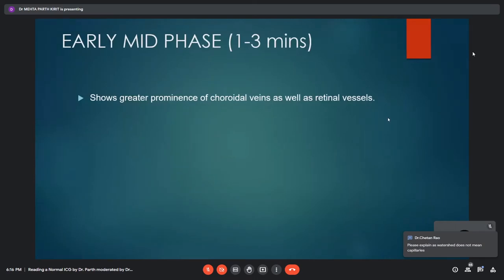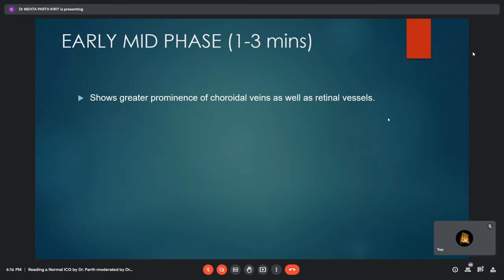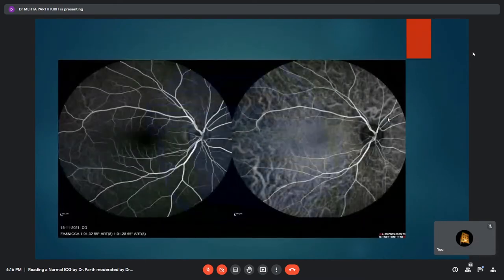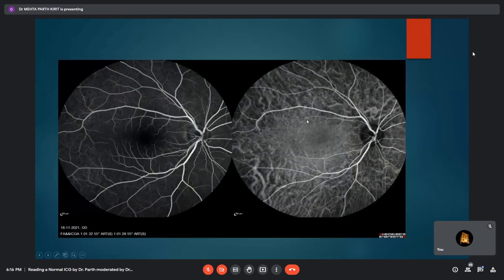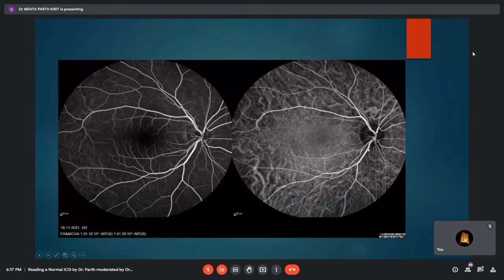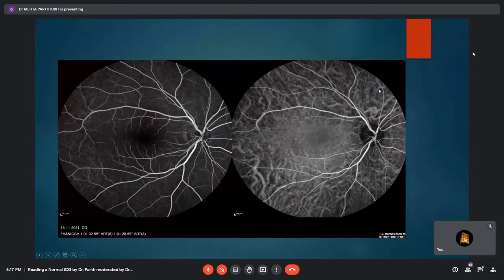Coming to the second phase — the early mid-phase, which lasts about 1 to 3 minutes — there is greater prominence of choroidal veins as well as retinal vessels. The choroidal veins appear as large caliber veins seen against the background of retinal vessels. The retinal veins are large, the retinal arteries are small caliber vessels, and the choriocapillaries and choroidal arteries are also visible.